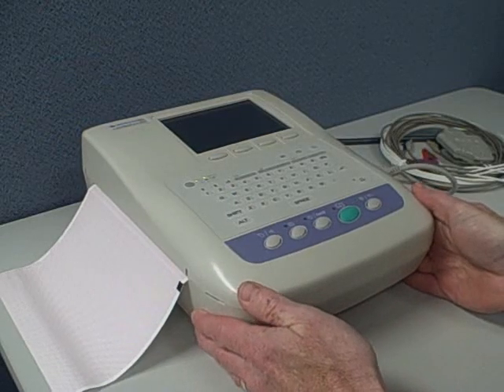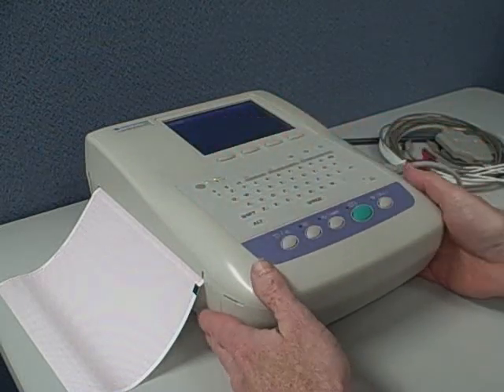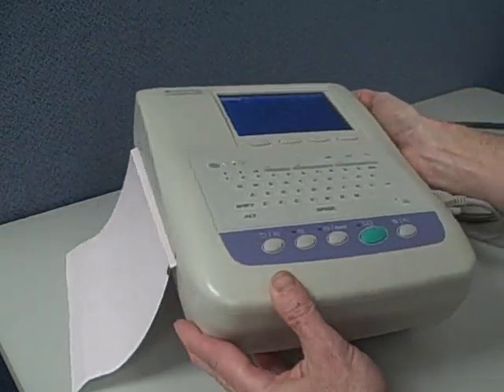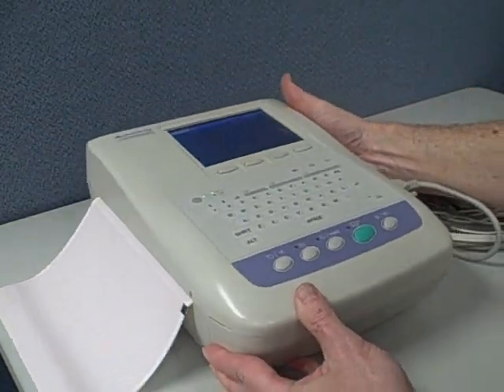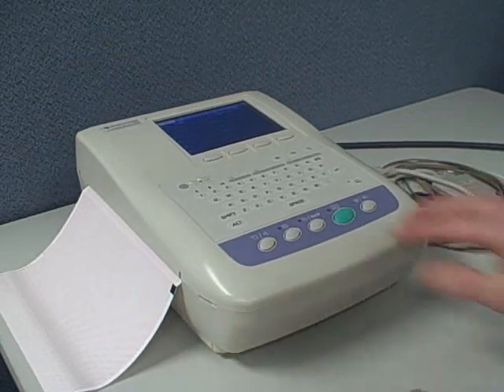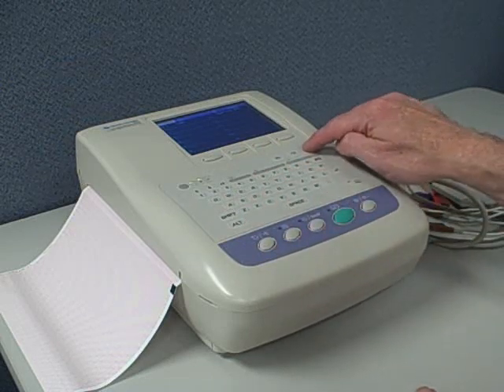Hi, this is Walt, and today we're looking at the Nihon Koden Cardiofax M EKG machine. It's a full-page printout — nice package. It really is one of the smallest in terms of footprint of a full-size EKG, about 8.5 by 11 dimension, about 5 or 6 inches high, and weighs about 9 pounds.